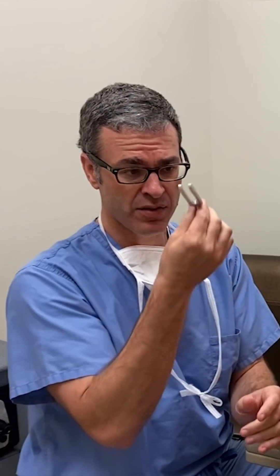The tuning fork test can help confirm that. For the Weber test, you put the tuning fork either on the forehead or on the teeth, and if she has fluid, the sound should lateralize to that side. The Rinne test checks whether air conduction or bone conduction is greater — if there's fluid, bone conduction should be greater than air conduction.